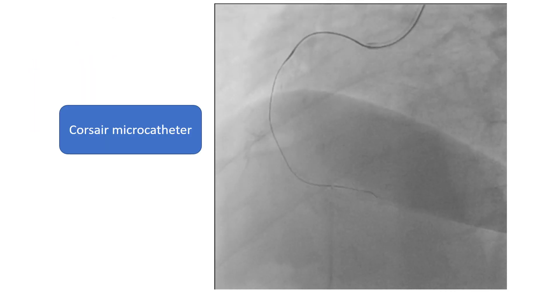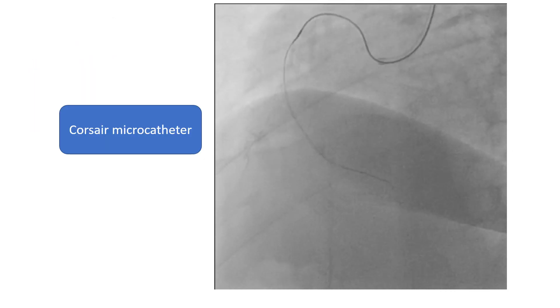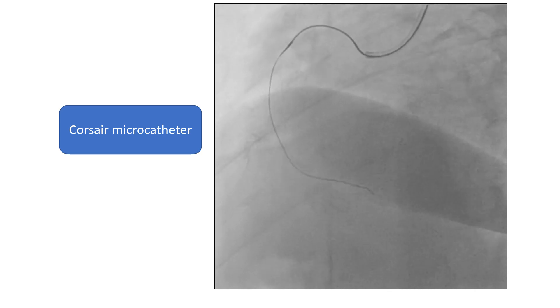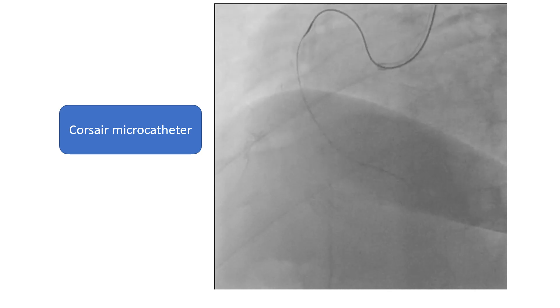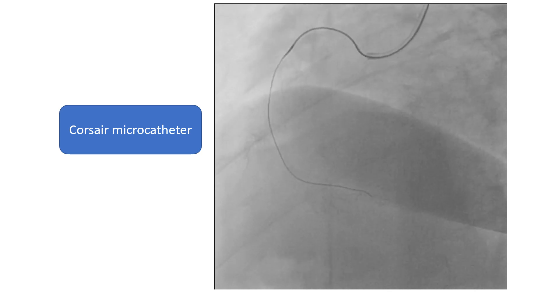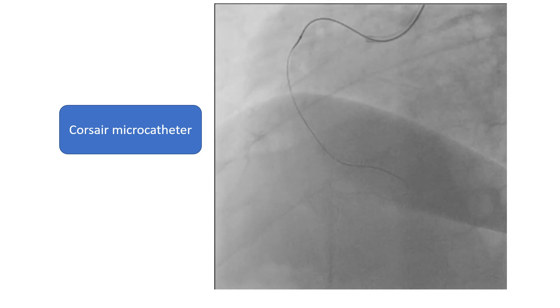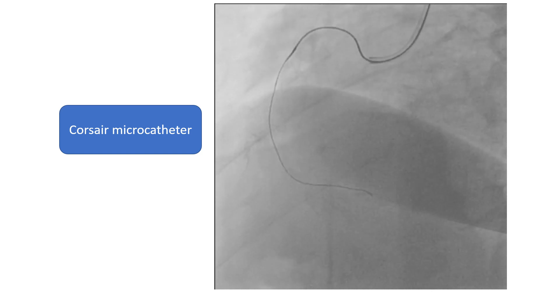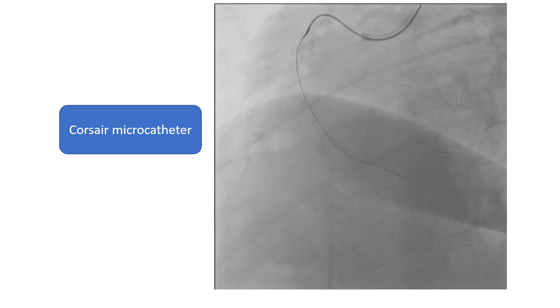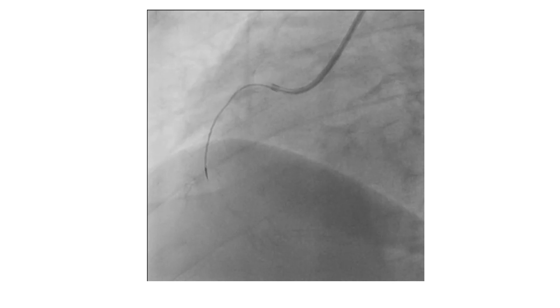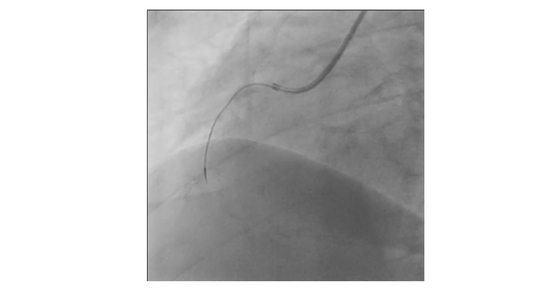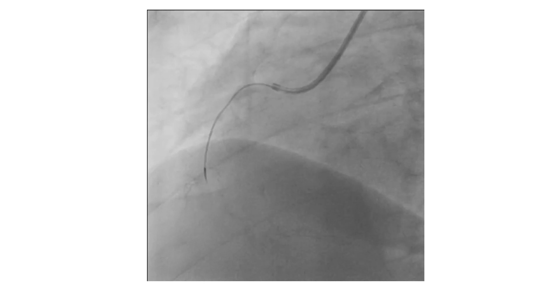Here we are using a Corsair microcatheter to cross the lesion. The advantage of this microcatheter is that you can rotate it several times clockwise and counterclockwise until you cross the lesion. Finally, the lesion is crossed. The workhorse wire was pulled back and exchanged through the microcatheter for the rota wire, and the microcatheter was pulled back.